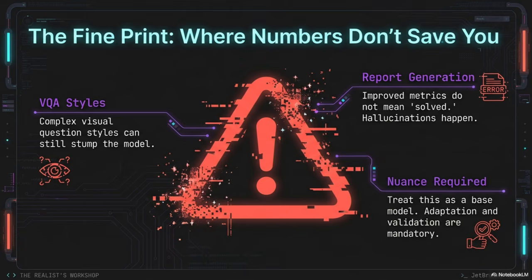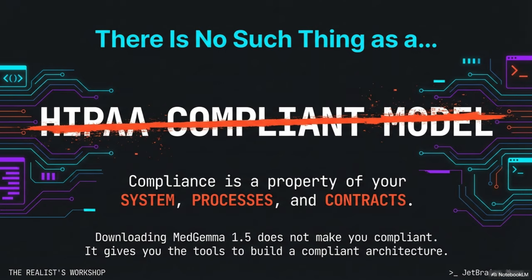I was most surprised by the low-level visual grounding. Anatomy bounding boxes measured by IOU improved dramatically. What were those numbers? The IOU metric went from a dismal 3.1 to 38.0. From 3 to 38. That is the definition of going from barely working to genuinely useful. That improvement alone tells you the model is far better at visually knowing where things are, which grounds all of its reasoning. And what about for EHR question answering? For EHR-QA, the accuracy saw a major lift from 67.6 to 89.6. That's a very strong performance for that kind of retrieval Q&A.